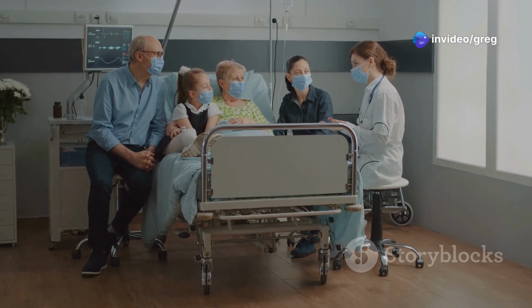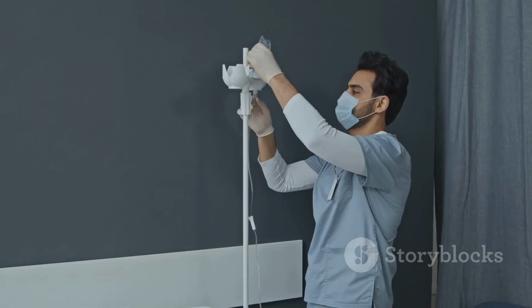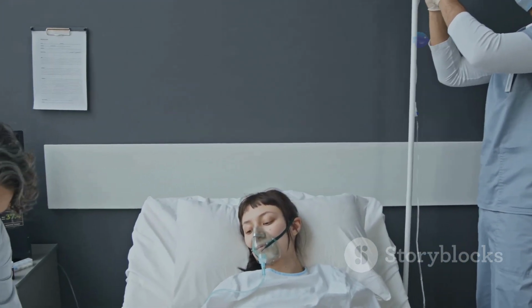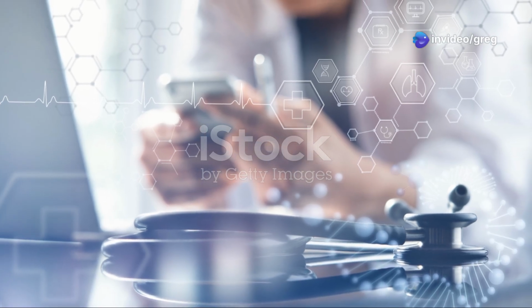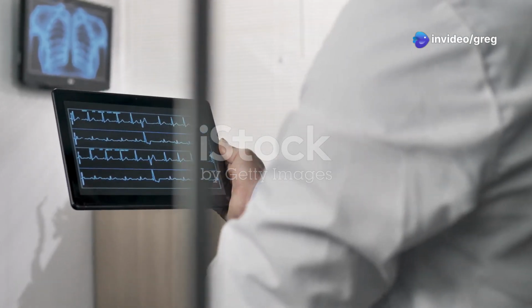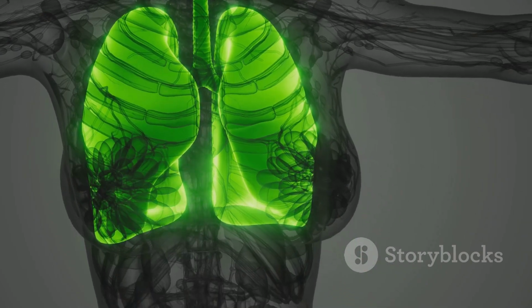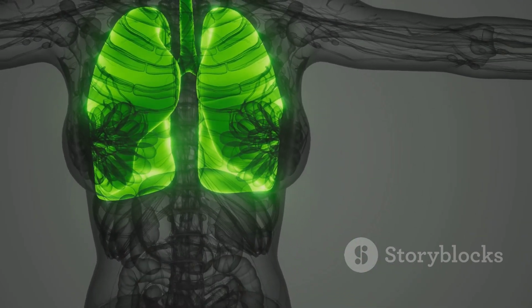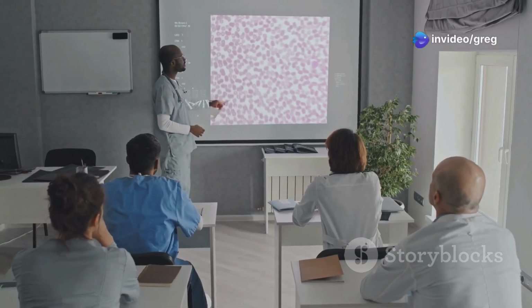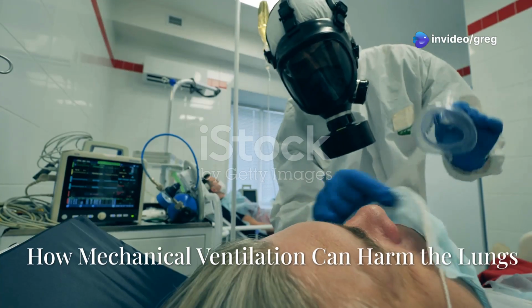While mechanical ventilation is essential for ARDS patients, it is not without risks. Mechanical ventilation can cause further lung injury if not managed carefully. This is called ventilator-induced lung injury, or VILI. VILI can result from the high pressures and volumes of air delivered by the ventilator. These pressures and volumes can overdistend the delicate lung tissues, leading to damage. Therefore, it's crucial to understand the potential dangers of mechanical ventilation and how to minimize them.